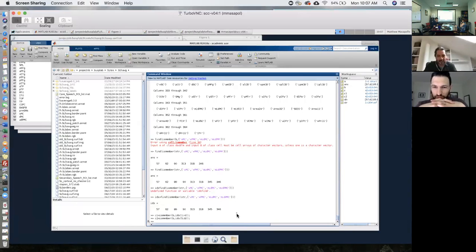Okay, so I can show you how to do that. SPM imcalc is a very general syntax. It works like this. I think you specify first the list of files that you want to use as original file. So in this case, it will be the FS average surf.img. Then you enter the name of the output file that you want to create. I'm going to call it FS average.